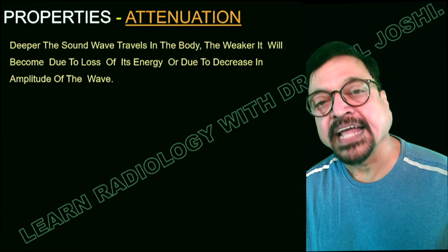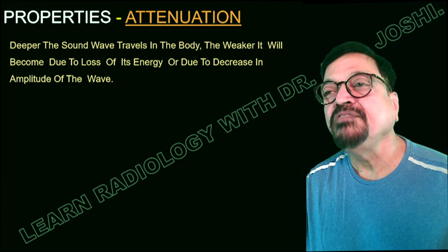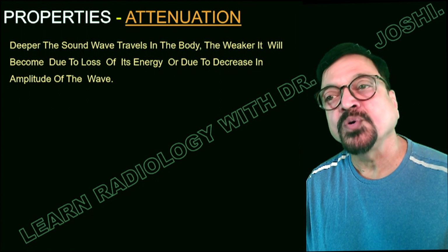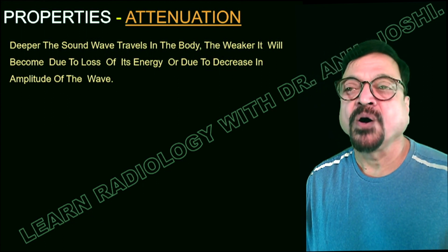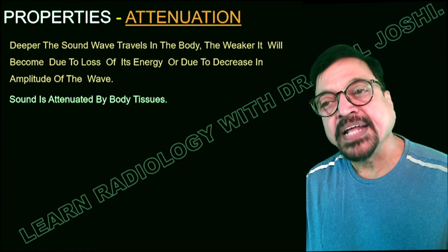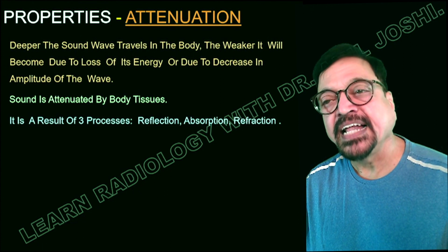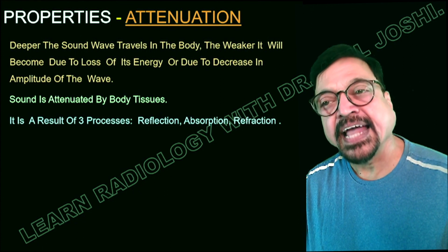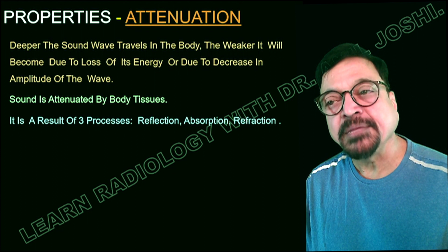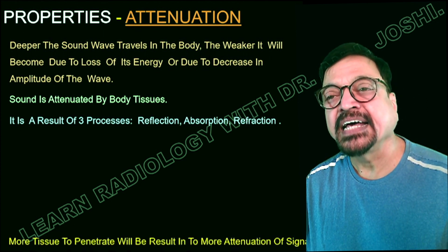Next is attenuation. The deeper the sound wave travels in the body, the weaker it will become, due to loss of energy or decrease in amplitude of the wave. Sound is attenuated by body tissues. Attenuation is a result of three processes: reflection, absorption and refraction.